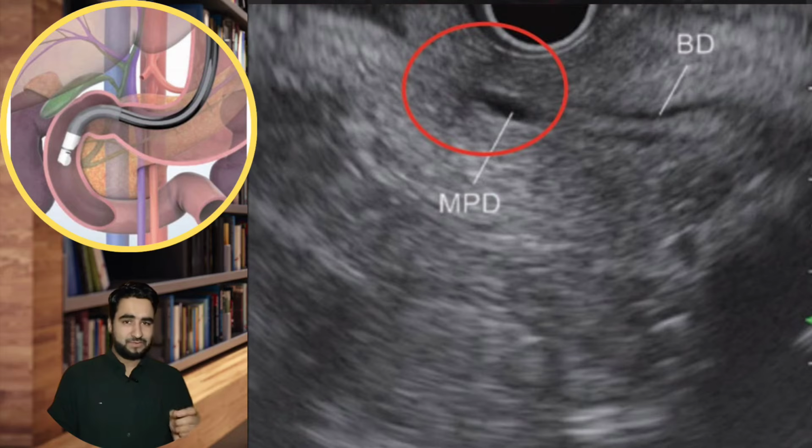Another thing that is important here is the distance of these structures from the transducer while you are in the descending part of duodenum. In the descending part of duodenum, bile duct will be closer to the transducer. That is why the upper tubular anechoic structure is bile duct and the lower one is pancreatic duct. While you keep withdrawing your scope, you can see these two tubular structures terminating in an oval anechoic structure. This structure is major papilla.